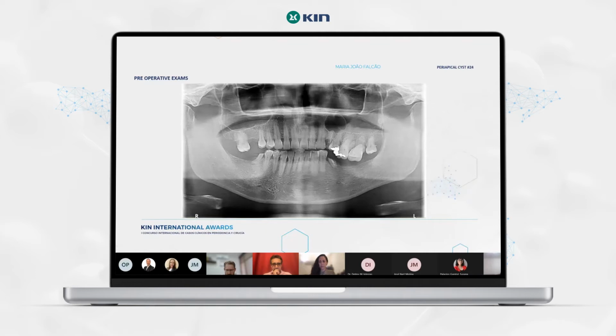We can see that he has a broken tooth root in the second quadrant with a big apical radiolucency, and also the dropping posterior tooth, as you can see, with no space to do anything in the lower. He also has 2 roots in the lower jaw. First of all, we gave him some antibiotics so we could control the infection.